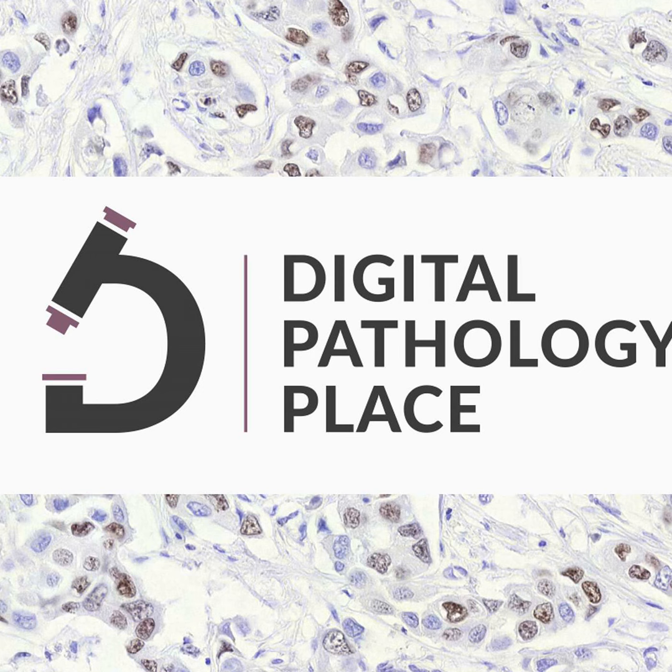So this is a potentially less burdensome way to keep up to date some of these systems, where some of the components are going to be obsolete in a year because the other manufacturers just don't make them anymore. And you don't want to have to do another 2,000 case clinical study just to keep a 510K in place. If you have to, you have to. But if you don't have to, then why? That's really not a good use of time, assuming you've done the design work and analytical testing.